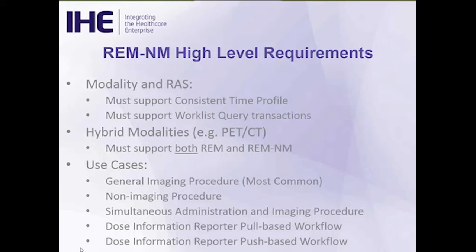So I'll go over the high-level requirements and then go through the most common use case here. So the modality and the RAS. One of the things, like Jeff mentioned, along with the activity that's important to note and move to the gantry, is because these are decaying over time. So we introduced a consistent time for both the RAS, the reporter, and the modality. So when the injection is reported and the time of the measurement of the activity of the dose is recorded, the camera is in the same relative time.